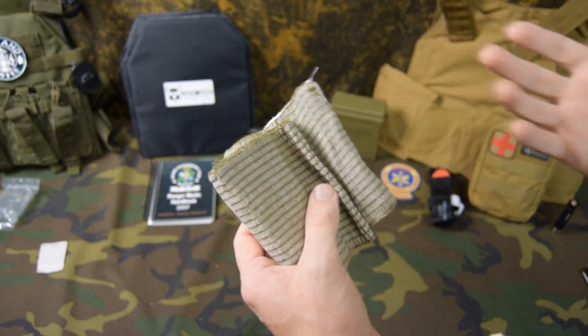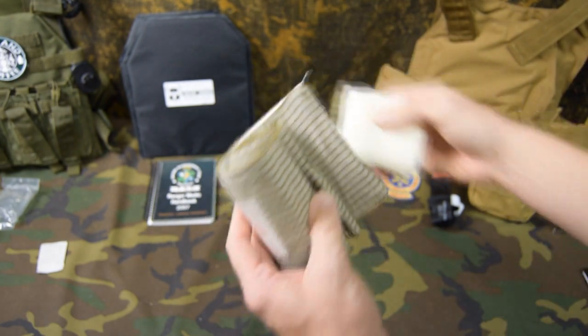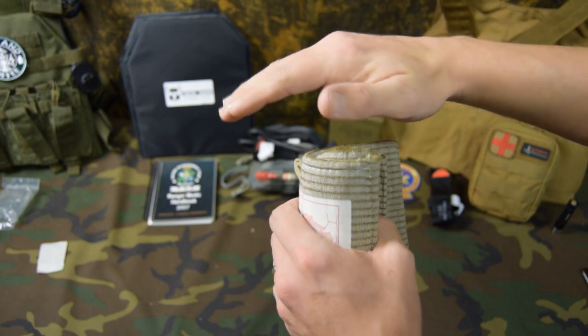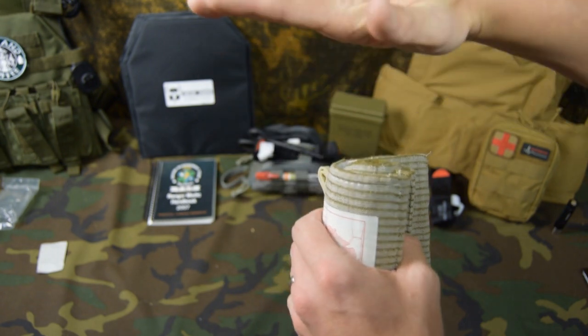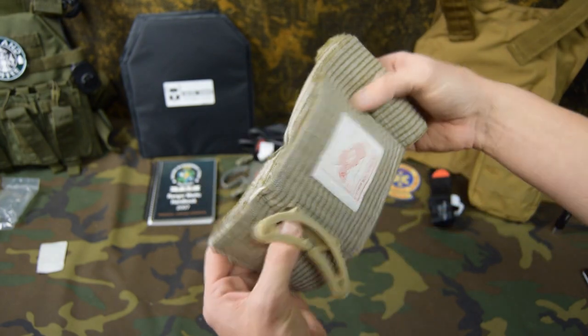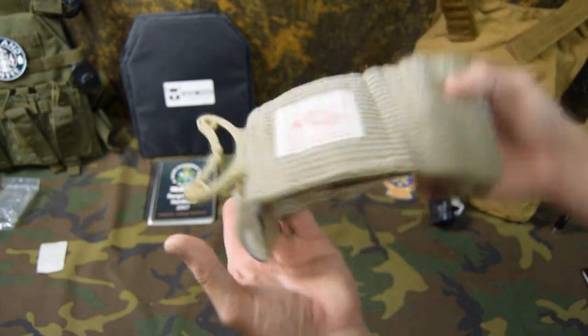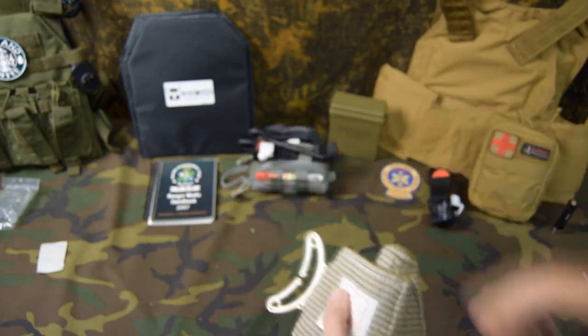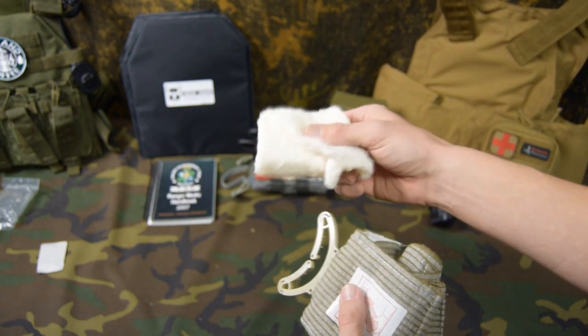Another item that would go good with this compressed gauze is a compression bandage. Because once we have the wound packed tight and we have a little bit of mound on top of the wound — so we can push that mound down to create more force inside the wound — you can actually take a compression bandage and wrap it. And that's going to hold that pressure for you while this gauze is helping control bleeding.